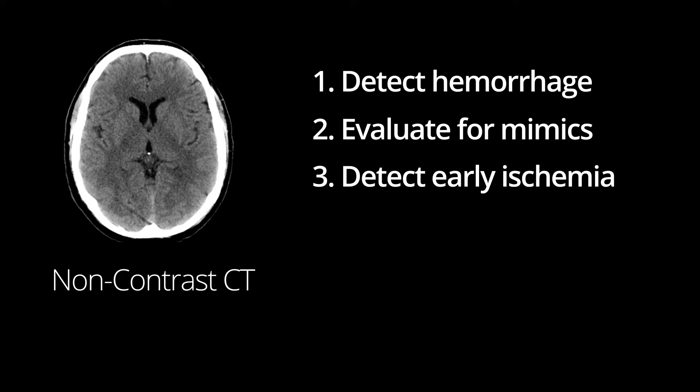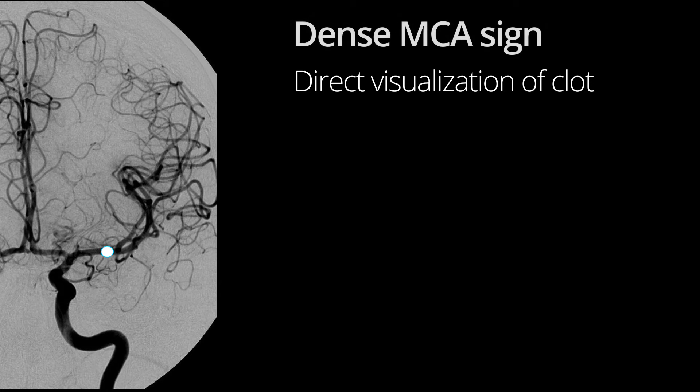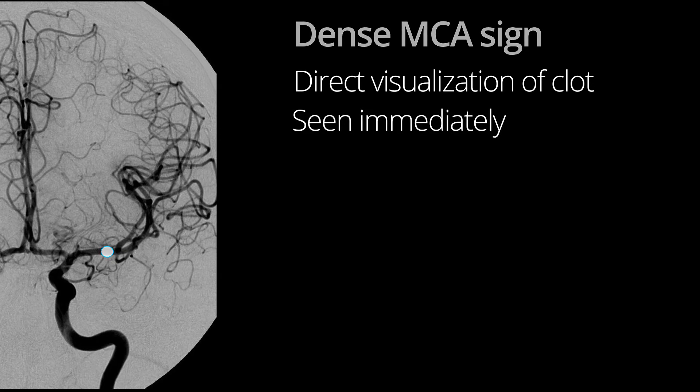There are some subtle CT findings that can be seen within the first 3 hours of ischemia. One such finding is direct visualization of clot within the lumen of an artery. This is the so-called dense MCA sign, and is the earliest sign of ischemia, given that it can be seen immediately since clot is denser than flowing blood.